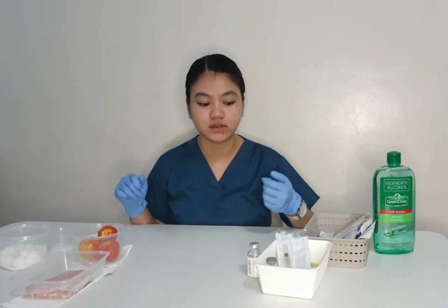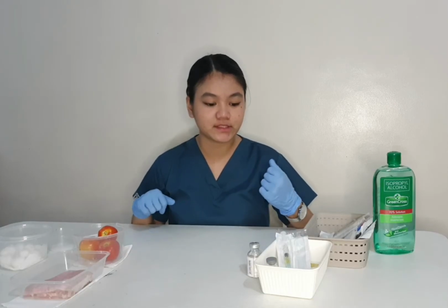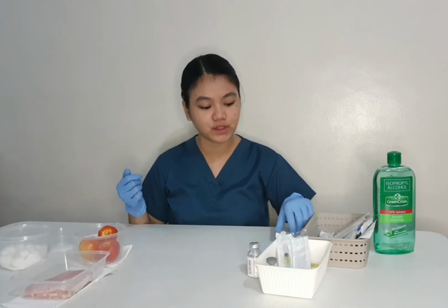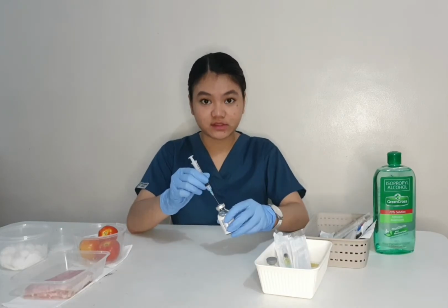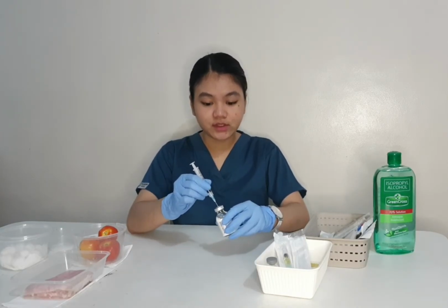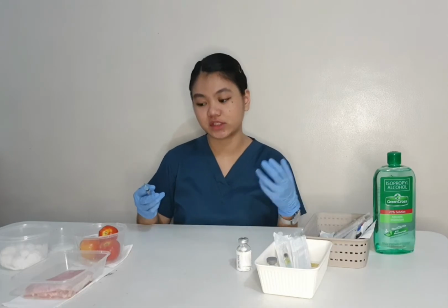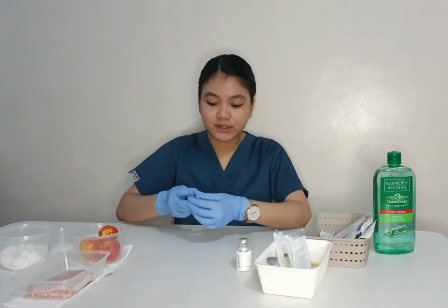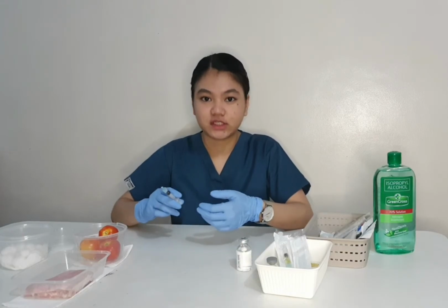So the reason why we need to keep changing the needle when getting the medication and upon administering it to the patient is because when we use the needle that is already injected here in the rubber, it will get dull already, and it will hurt the patient when we inject it to them. So it would be better if we change the needle upon injecting it to the patient.